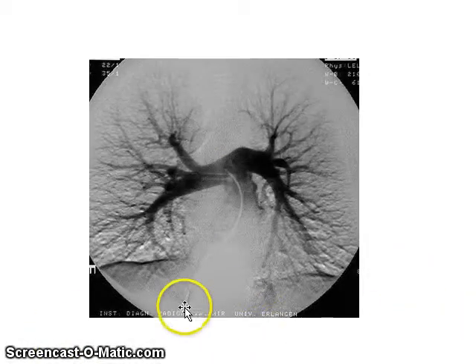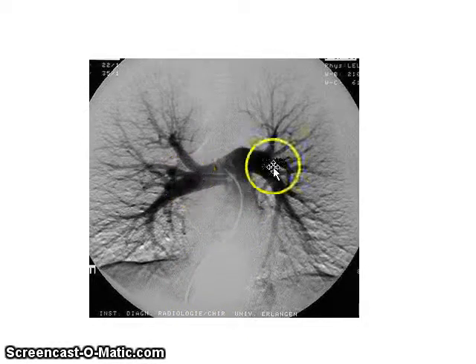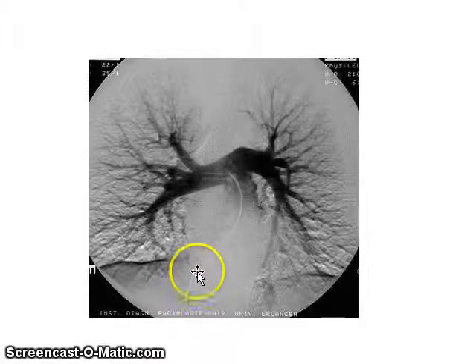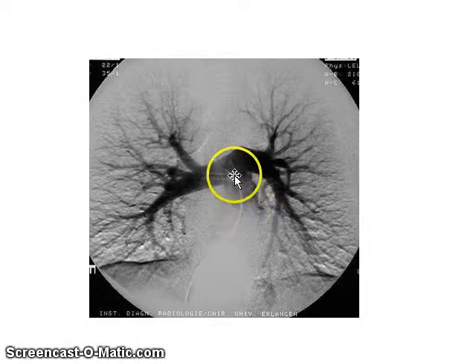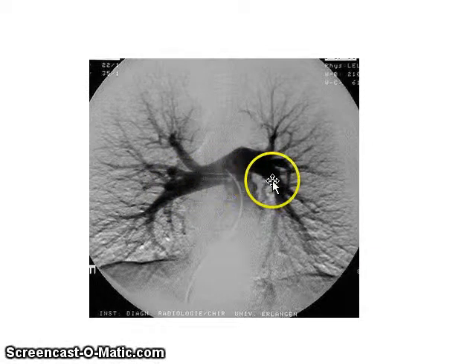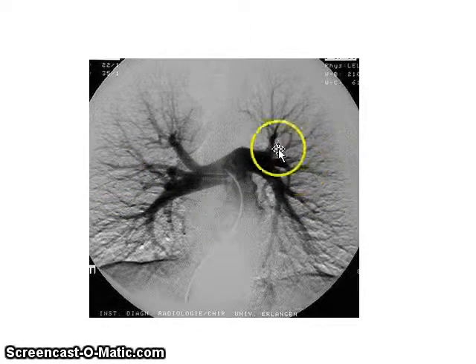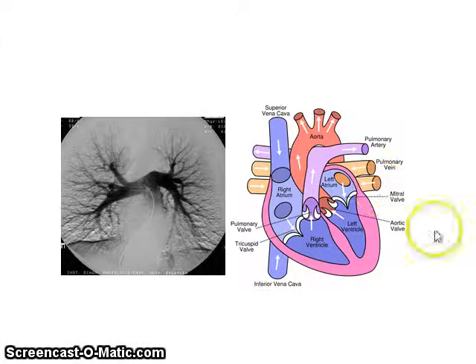This is another example of a pulmonary arteriogram. The image is inverted, meaning that the contrast is now showing up black instead of white like the other picture. But this looks more like a femoral approach. So again, they access the femoral vein, and then go up the inferior vena cava to the right atrium, right ventricle, through the pulmonary valve, into the pulmonary arteries, inject contrast, and that's when it goes into the right and left pulmonary arteries. So again, this is all a venous system, and that's extremely hard to remember, but yet very important. This drawing kind of helps you visualize it.